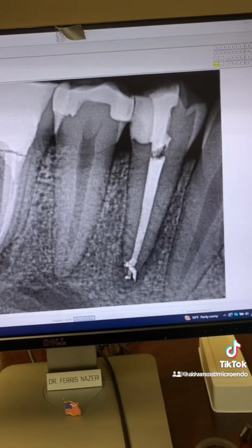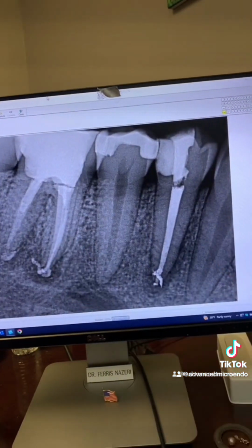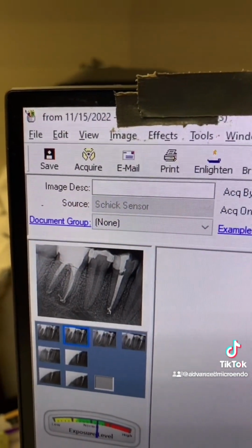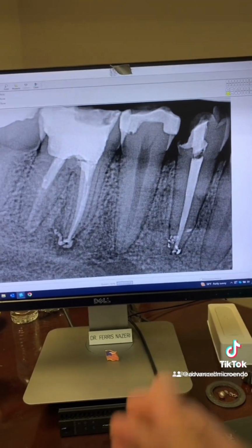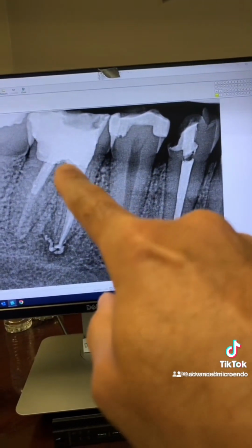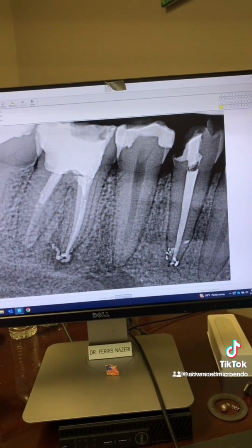You can see periapical lucency there. And that's tooth number 30 that we worked on, of course. And here's the date. As you can see, about 8 months ago. And this was just now, today. 8 months post-op of teeth number 28 and number 30. Patient still hasn't gotten teeth number 28 and number 30 permanently restored.